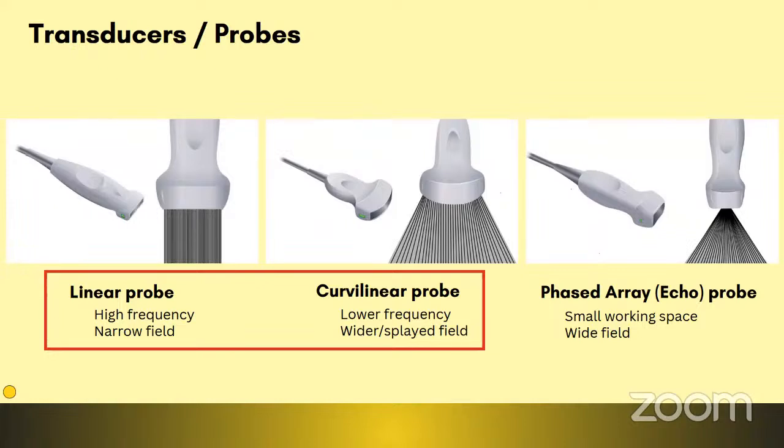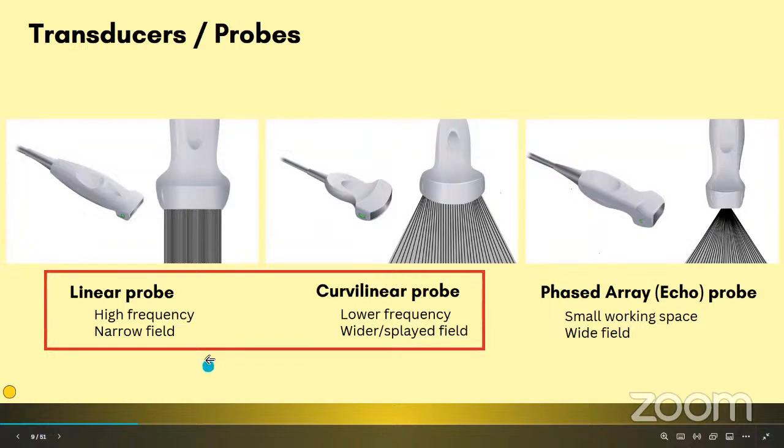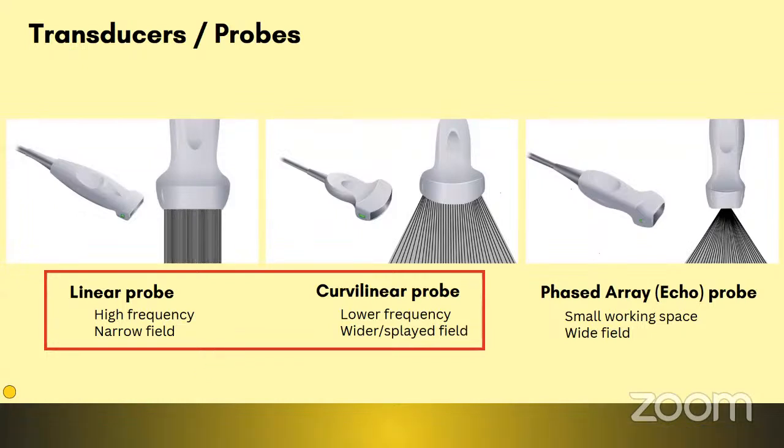As soon as the pulse enters an organ, it would hit a lot of particles in the tissue because, of course, every material is made up of molecules. Higher frequency waves mean there are more sound waves in a limited amount of time. So these would get into a material, hit multiple times, and there will be faster attenuation. Hence, before it enters a deeper structure, the pulse would die off pretty soon. So higher frequency probes have very little penetration. However, since they are interacting with a lot of particles in the tissue, we get higher resolution.